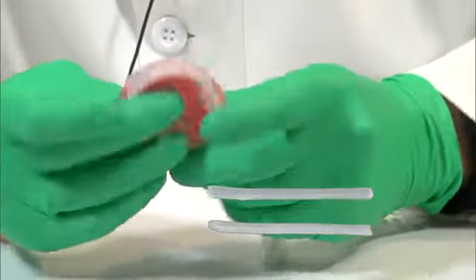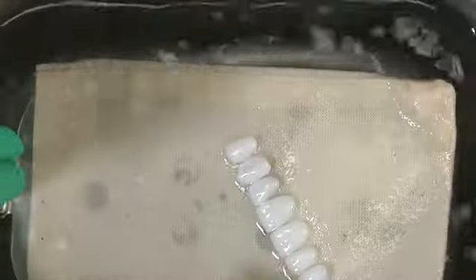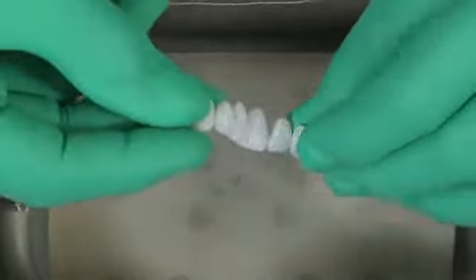Here, Dr. Masad is using the patient's existing denture and applying a thin strip of white wax over the anterior teeth. Place the set of Visionaire Dental Shells into a hot water bath at 175 degrees Fahrenheit or 80 degrees Celsius for 10 to 15 seconds.